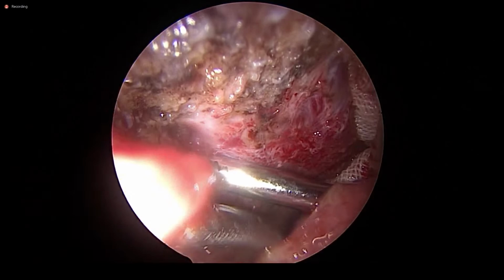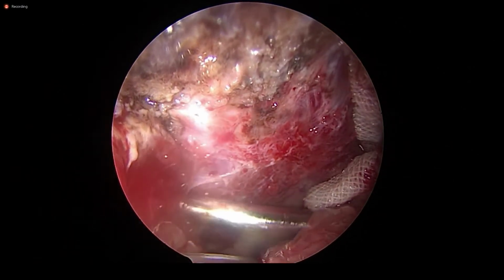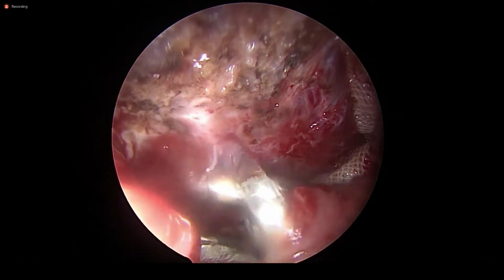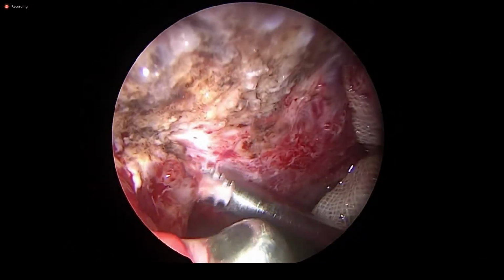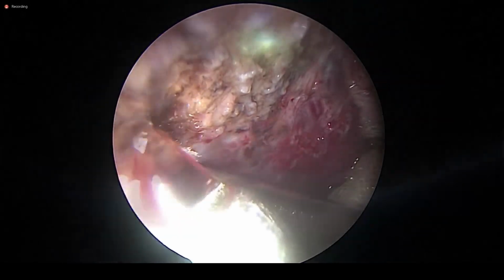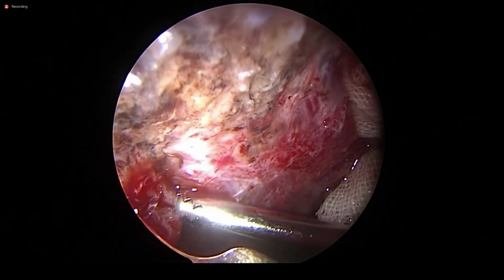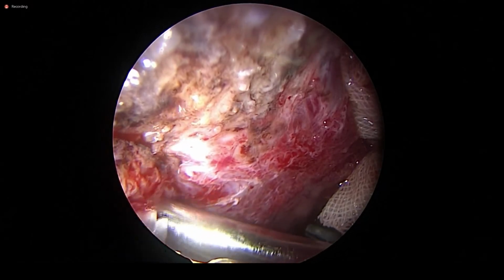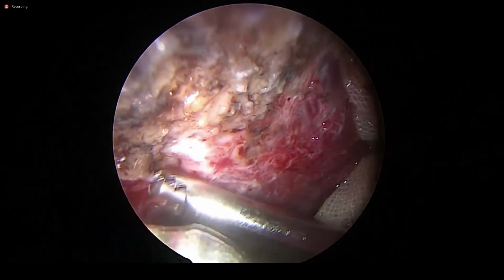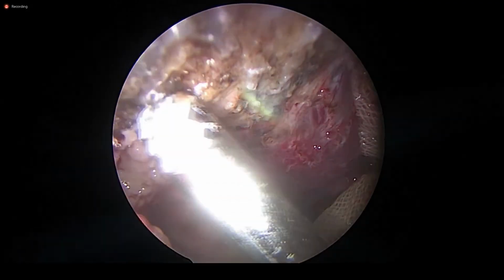Hold on. These are laterally hypertrophic adenoids which are responsible for the persistent problem.